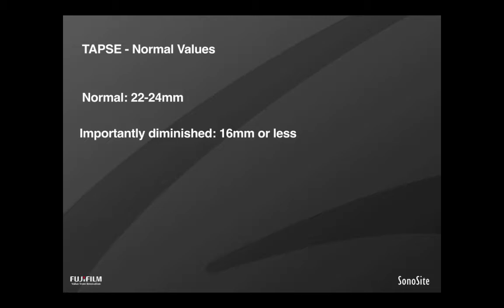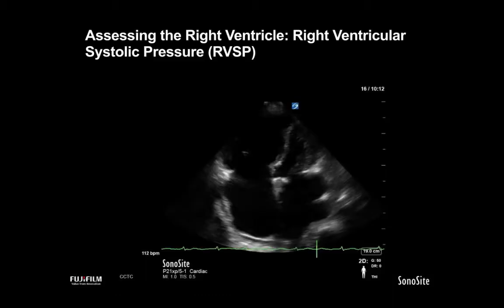Again, I would actually emphasize that I don't find it incrementally adds a lot of value to my assessment. However, it does give me a number to hang my hat on, and frankly is somewhat enjoyable to do and further deepens one's understanding of more comprehensive echocardiography and M-mode techniques to use it.